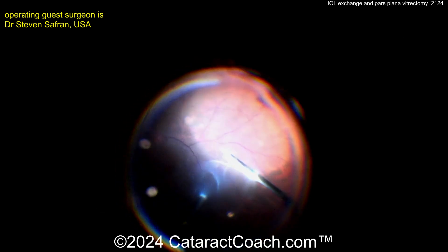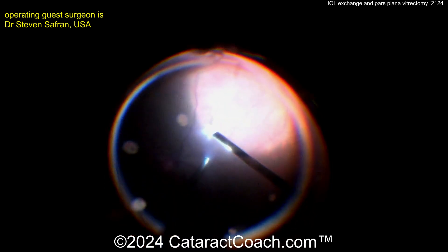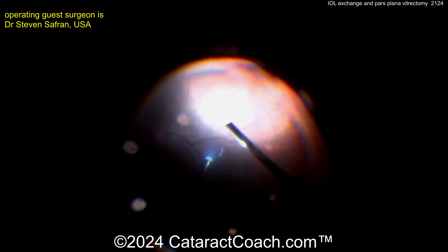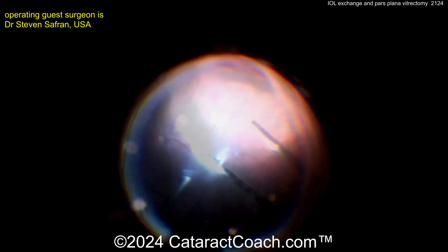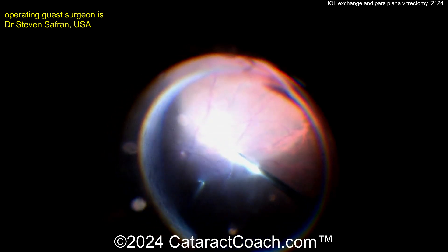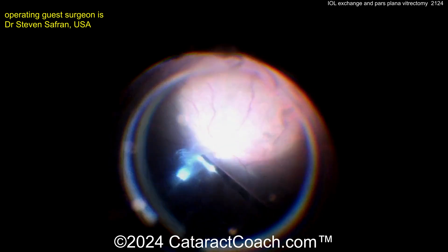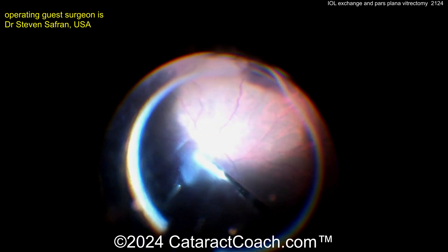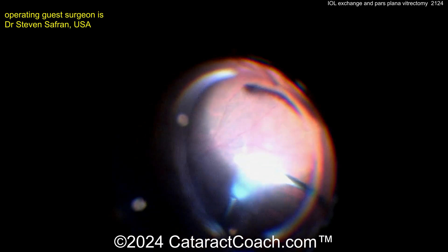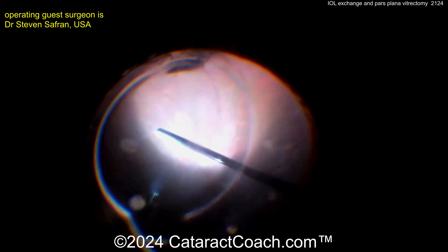Pars plana three-port vitrectomy, just to clean out all the debris that's in the vitreous. You can see all that vitreous syneresis — a lot of floaters, maybe a Weiss ring going down too. No wonder the patient wasn't happy with the quality of vision, because especially with a trifocal lens, all that vitreous opacity can degrade image quality even more. As you know, any trifocal lens is going to cause some degradation of contrast, and by having all these vitreous opacities, that's going to make it even tougher.